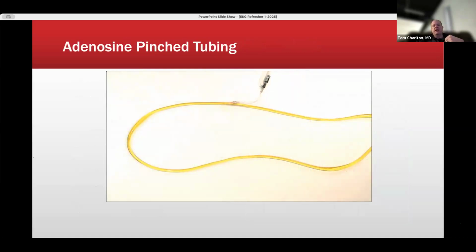So with this, they have a wide open normal saline infusion going. They pinch the infusion, inject, and then release the pinching of the tubing. So we get this very quick flush through. So we'll watch it again.